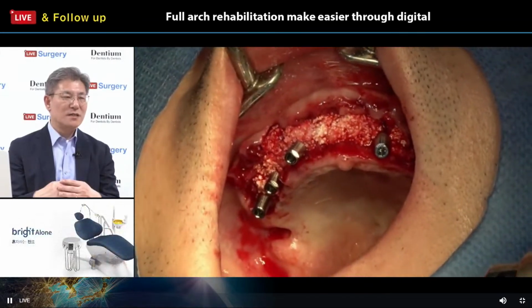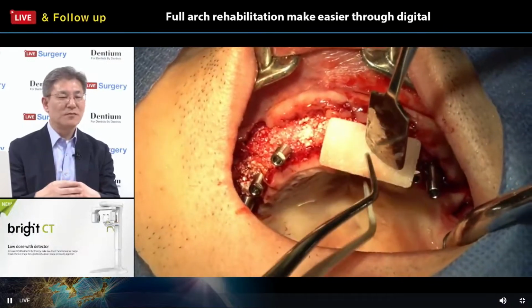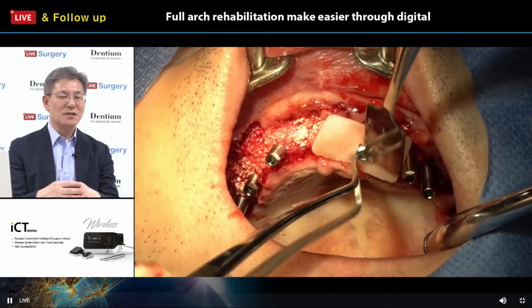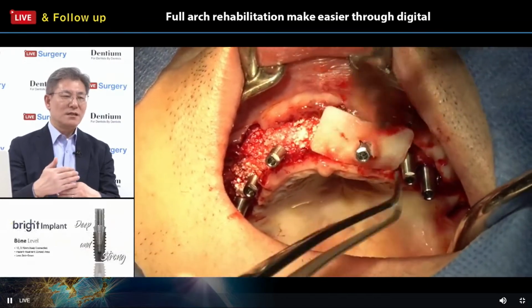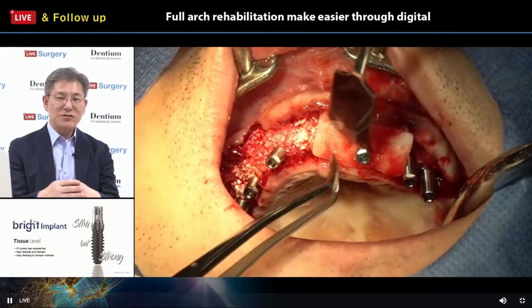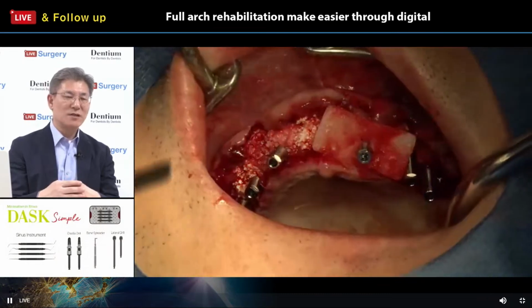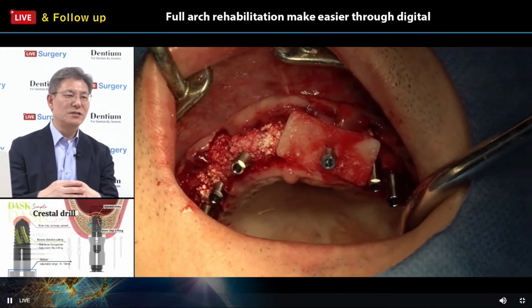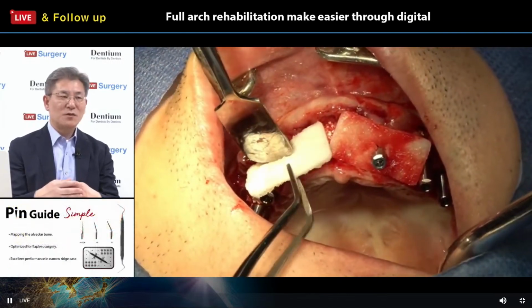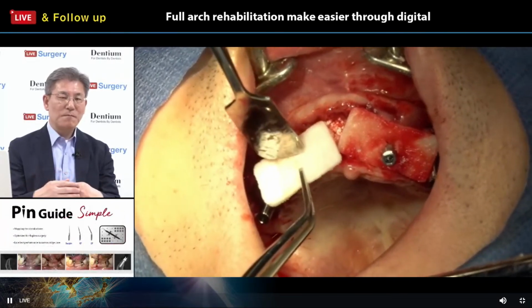However, this Geno collagen gave us a good performance in new bone formation, a little bit better compared to the alloplastic Osteon 3 collagen. So, in the induced area connecting with the implant fixture, this Geno collagen is better than the Osteon 3 collagen from alloplastic material, right? And this Osteon 3 collagen has a good performance maintaining the volume.